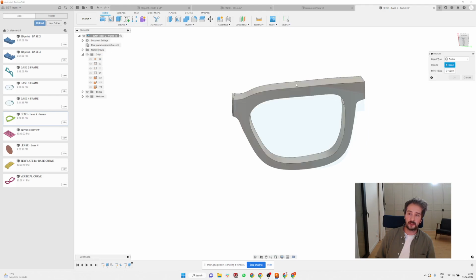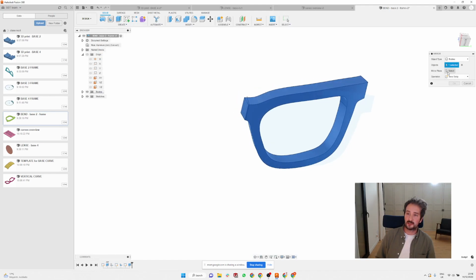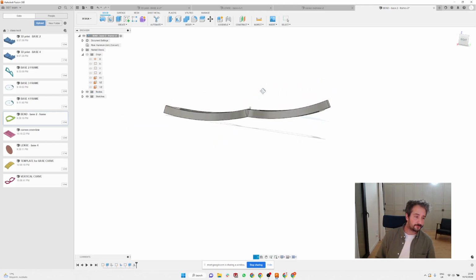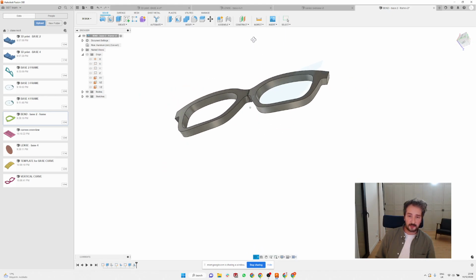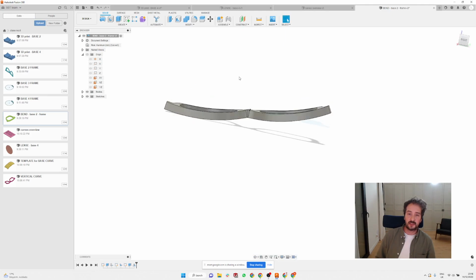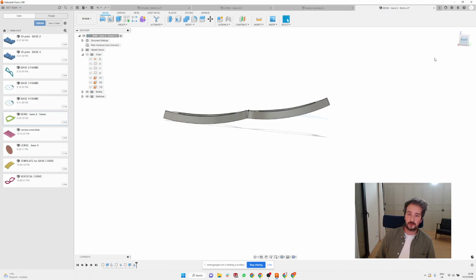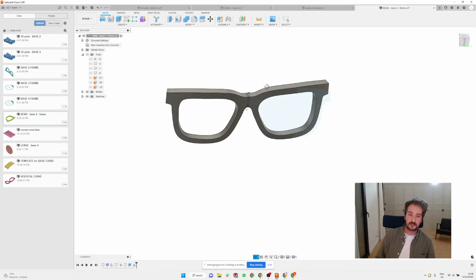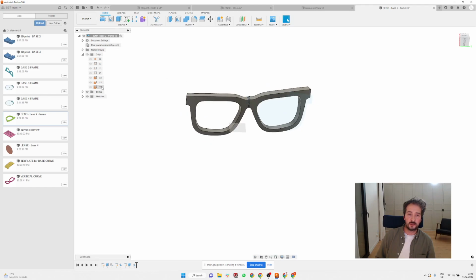If you press the mirror now, select the object and select this plane, it's now almost straight. It looks weird because it doesn't have the bridge bump, but you can see that if I look from this view, you have just a base curve on the lenses, but overall the frame is almost straight.